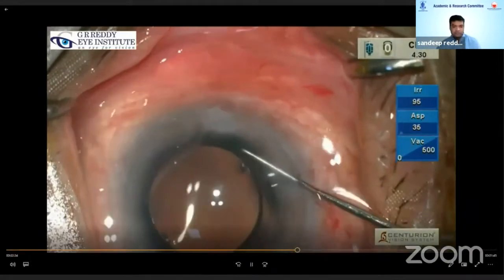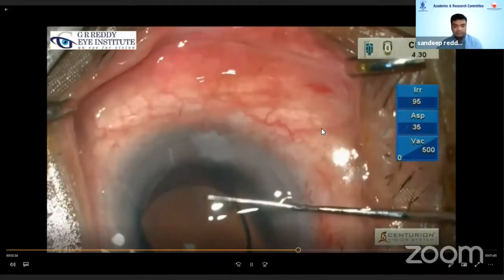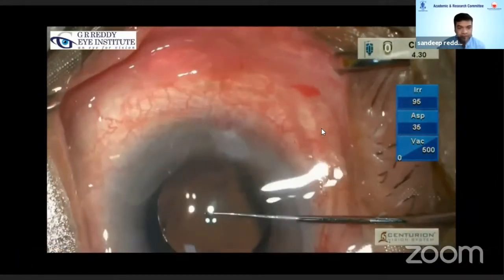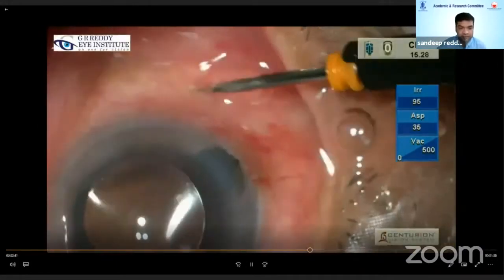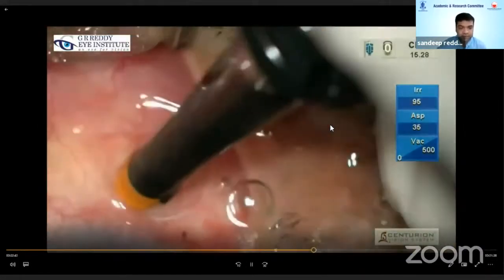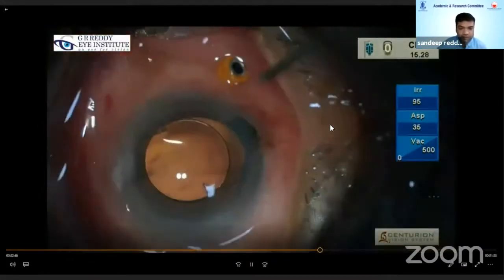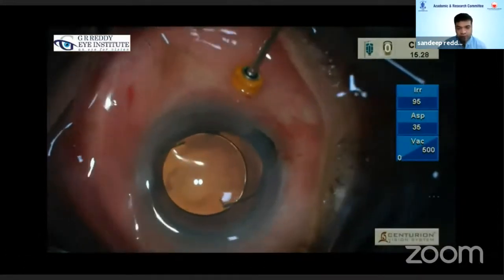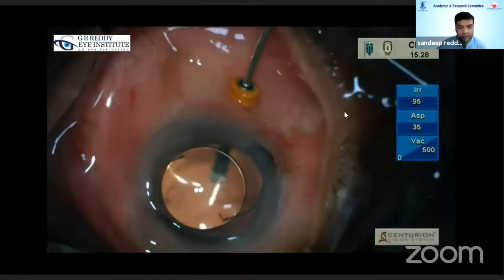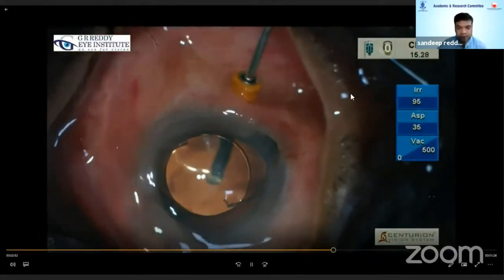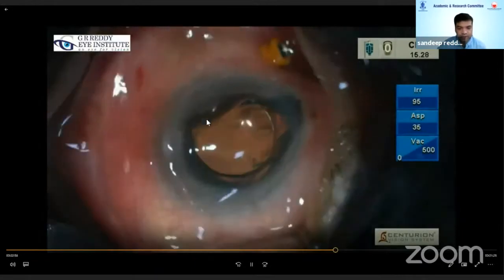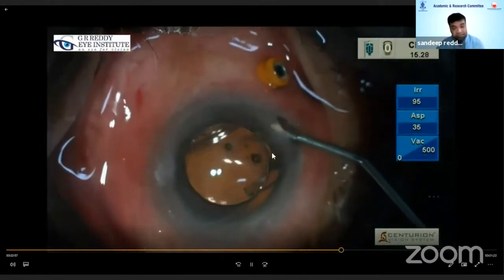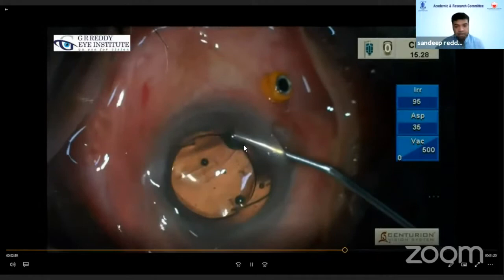At this point, I put in a 23-gauge trocar cannula and again did a minimal dry vitrectomy to make the eyeball a little softer. Once done, you can see the entire eyeball is soft and then I was able to insert the IOL. Normally if I am doing this at the beginning of nucleus management, I don't recommend making the eyeball too soft, as that can cause a nucleus drop.